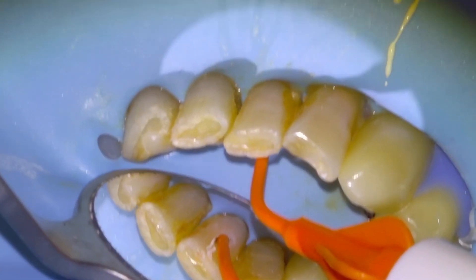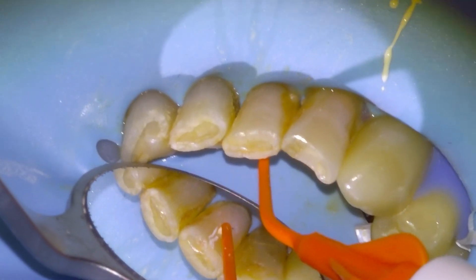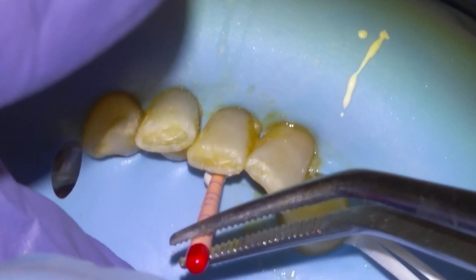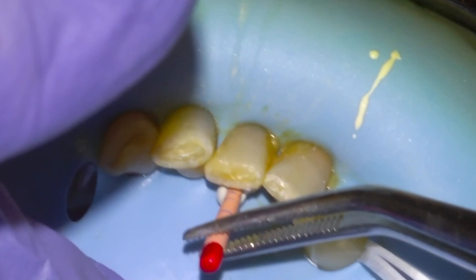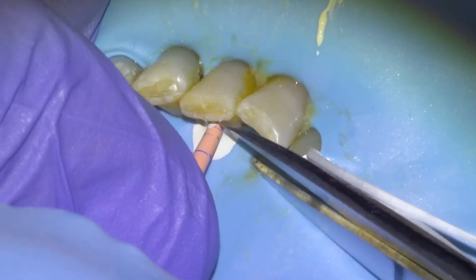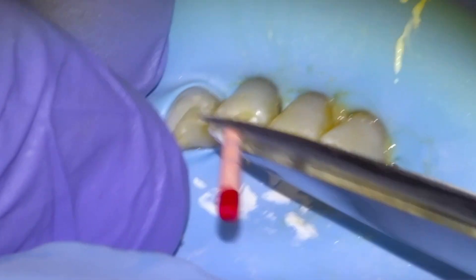We start filling up the canal and pulp chamber, then slowly retract the tip so we don't make any air bubbles. Then seating our cone to length, kind of tamping it up and down a little bit so that we get a good puff out the apex. Snip the excess GP and sear it to the CEJ margin.